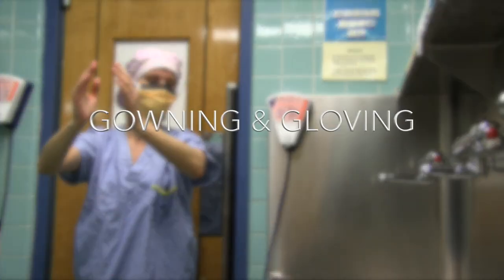Hi, so now that you know how to scrub, you now need to learn how to gown and glove without contaminating yourself or the surgical field. Gowning and Gloving.